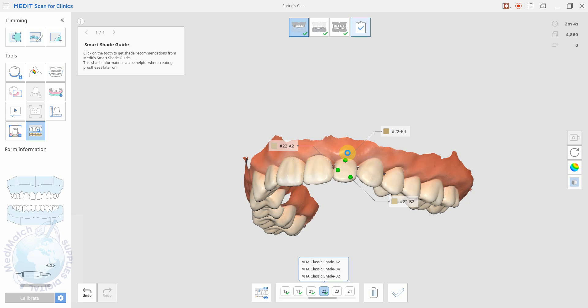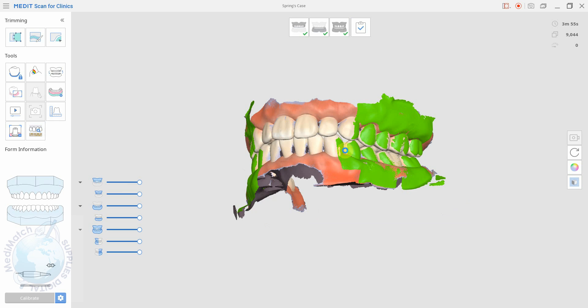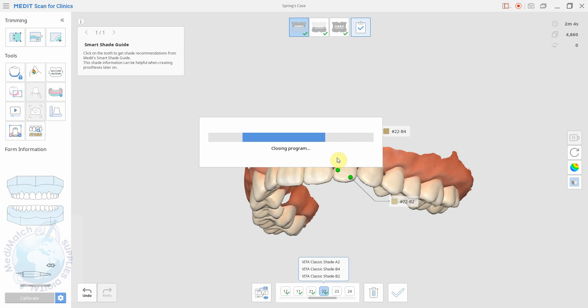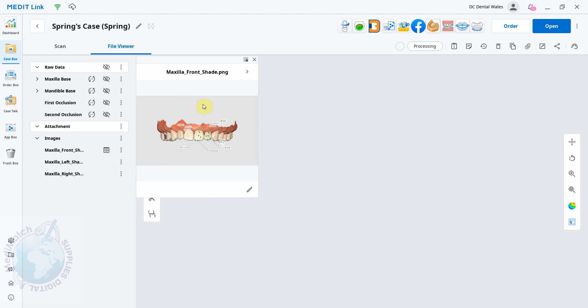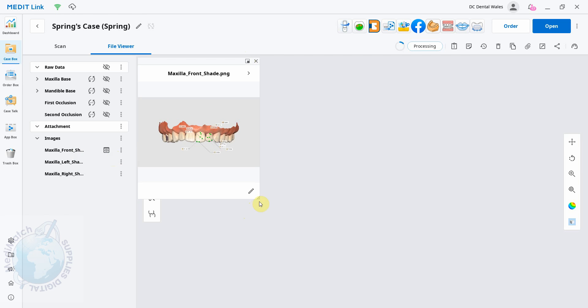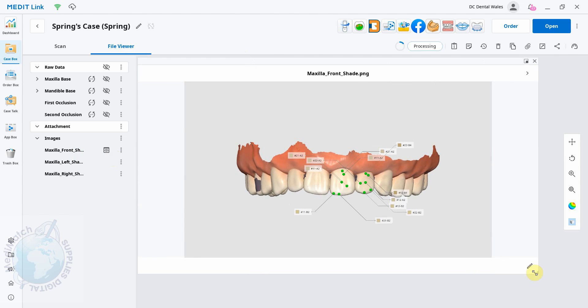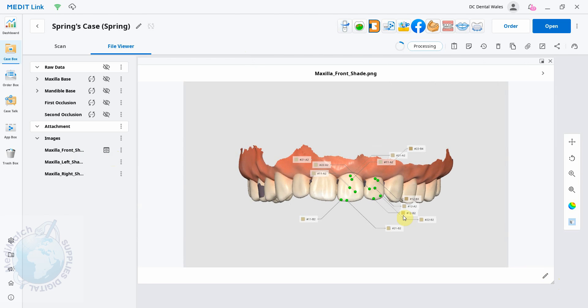save it as normal. And we come back into MetaLink and it's processing. You see you have these images down here, and if we click on it we can see the image.